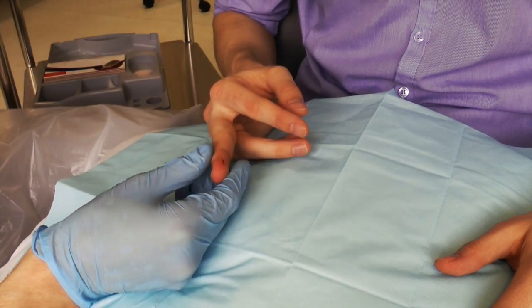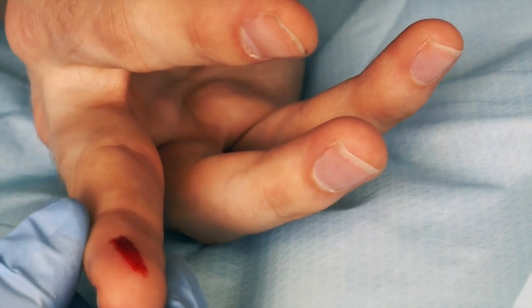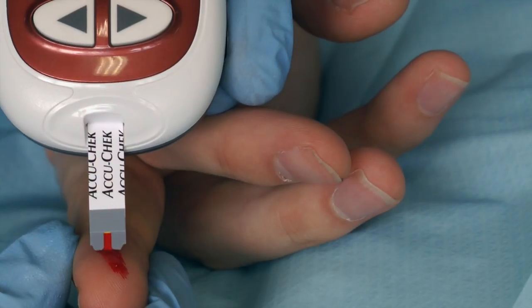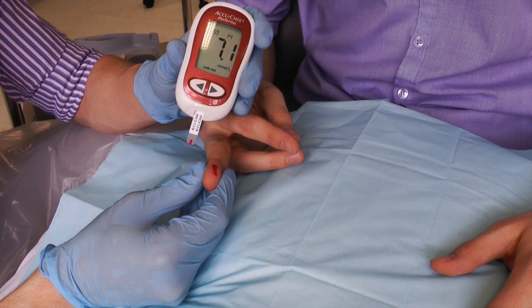Allow a small blob of blood to form on the skin. Apply the testing strip, noting the blood staying in the marker as the sample is taken. The monitor will then show the blood glucose reading.